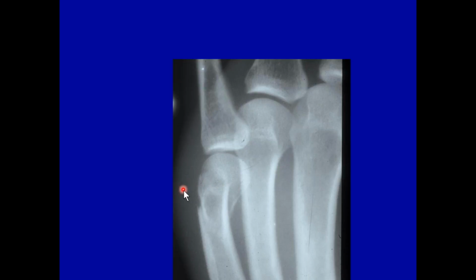So when you hit something, there's turning. There are forces that cause a certain amount of twisting, and that's why you get the neck of the metacarpal head fractured. They go to the doctor, or a chiropractic office if that's the scenario, and you're asked to do a hand x-ray. And you know where the x-ray goes for that particular examination.